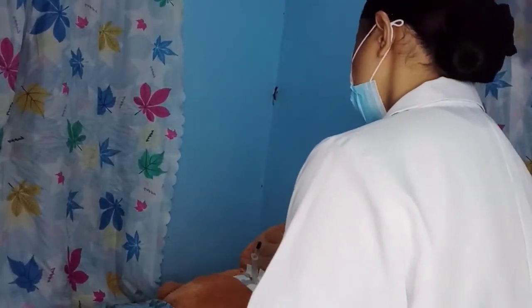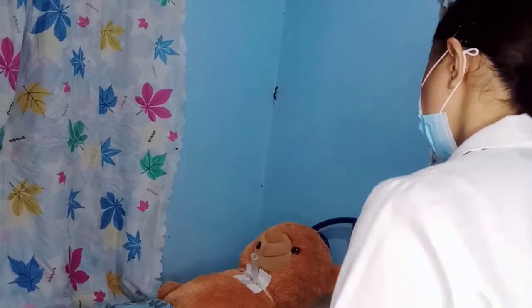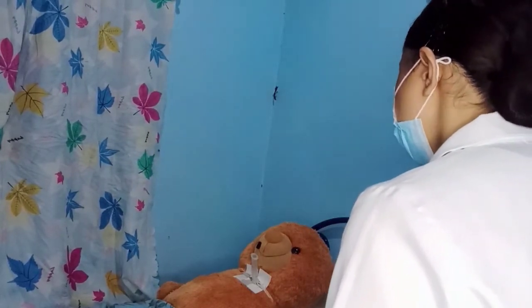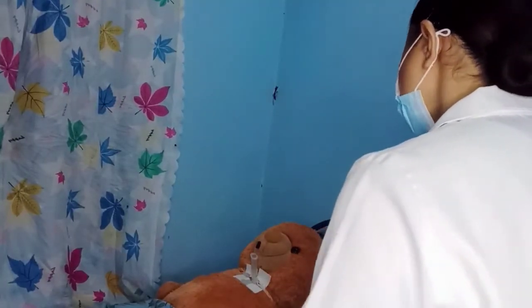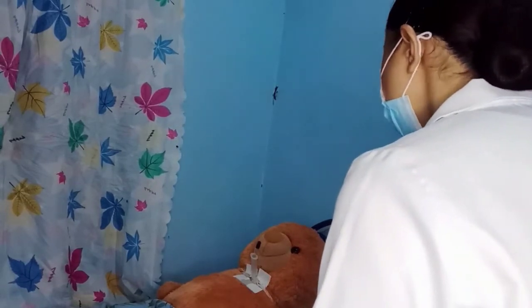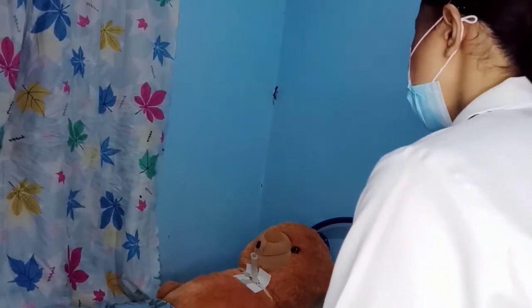Next, explain what we are going to do and the reason to the patient, even if the patient does not appear to be alert, because they deserve to know what we are going to do. Good day again sir, I'm here to provide your tracheostomy care. Tracheostomy care is done to keep your tracheostomy clean, to prevent tube blockage, decrease the risk of infection, and to help clean and remove secretions from the airway so oxygen can be delivered to the lungs more easily and safely.